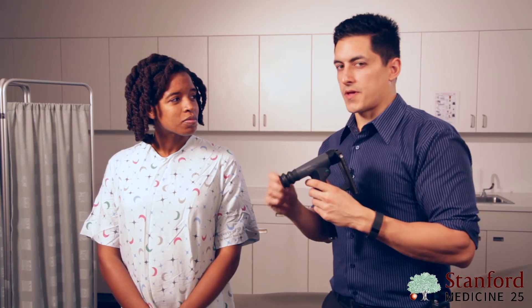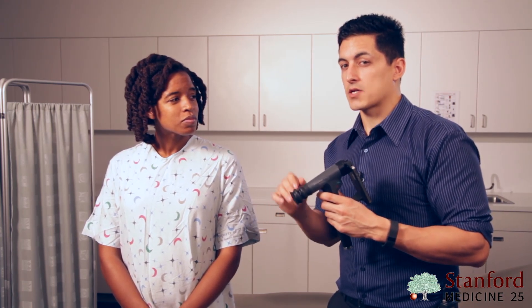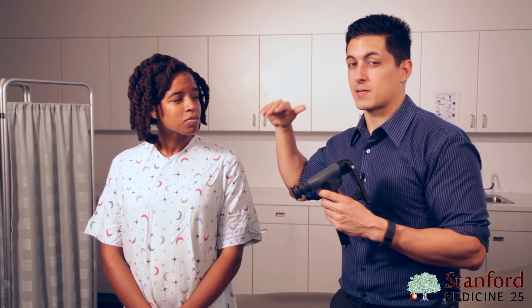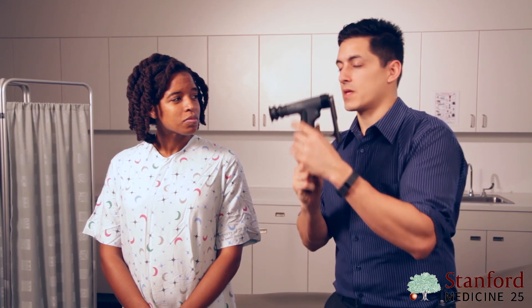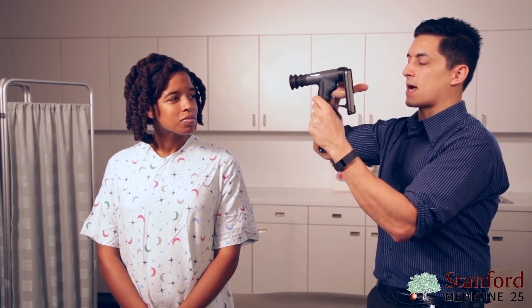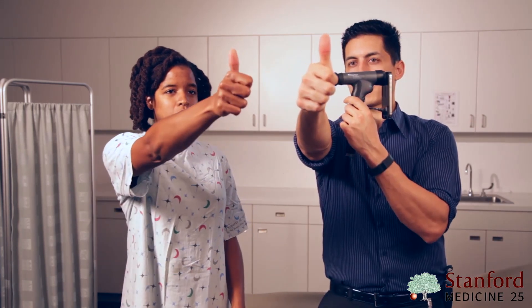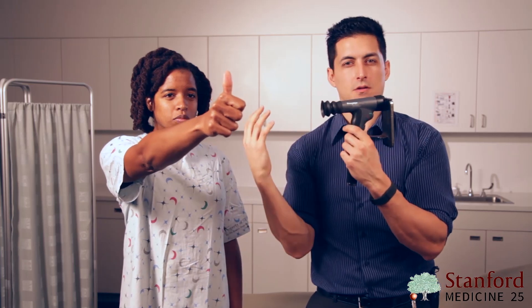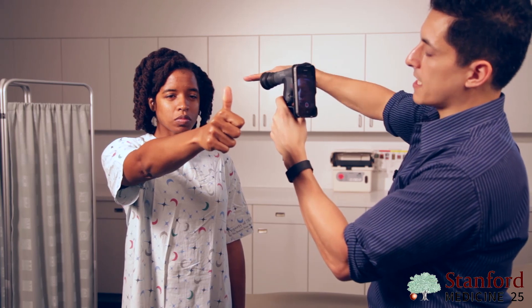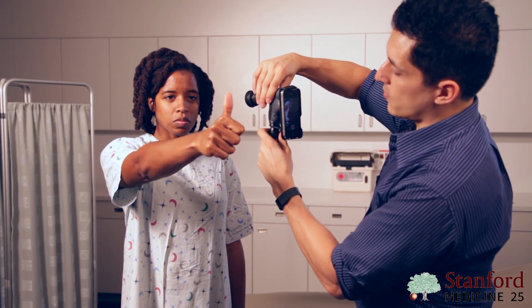Another important thing to keep in mind is patient positioning. Whenever you're looking at someone's retina, you have to make sure your ophthalmoscope is at the same height as their eyes, whether they're sitting or standing. I usually ask the patient to take their thumb and stick it straight out ahead of them — so I'll have her stick her right thumb out as I look in her left eye — and I make sure my level is the same height. Then I come about 15 degrees from center and look for something called the red reflex.